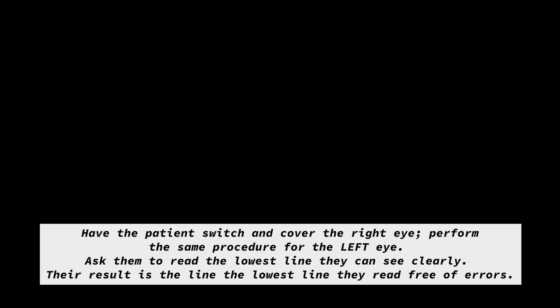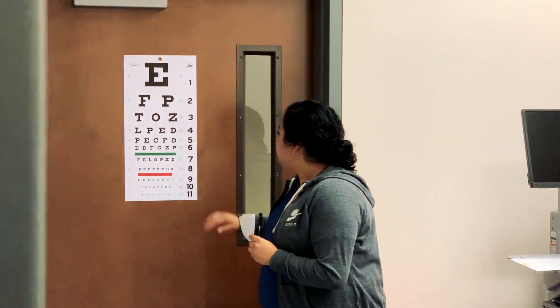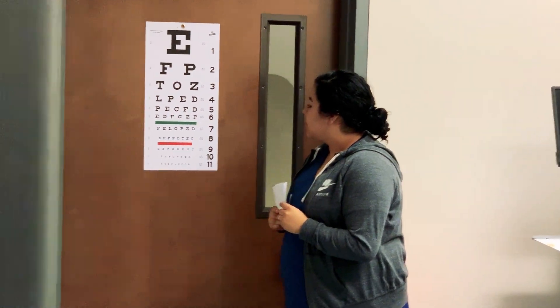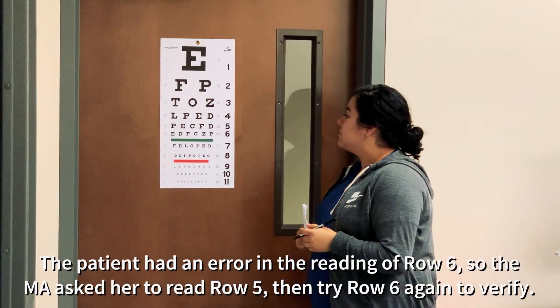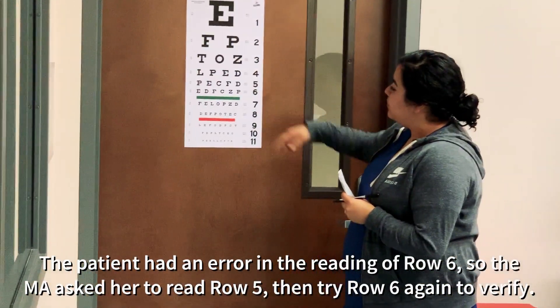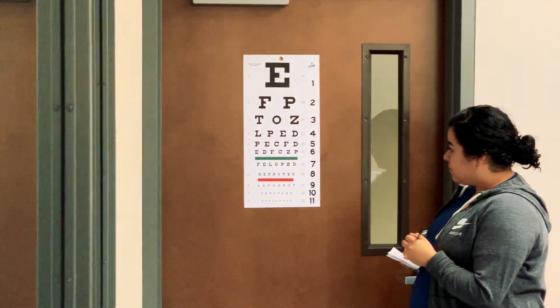Okay. Row 5? And can you start with row 6? Yes. So it's E-D-T-C-Z-P. Row 5? Okay. P-E-C-F-D.